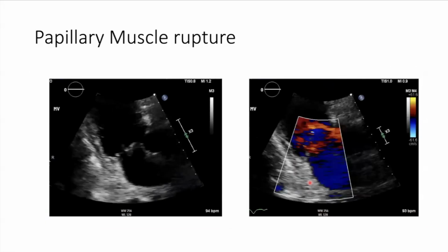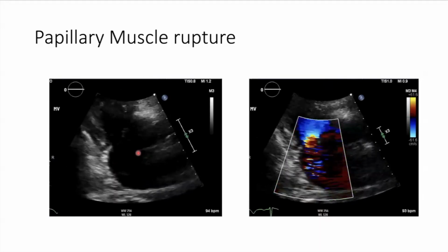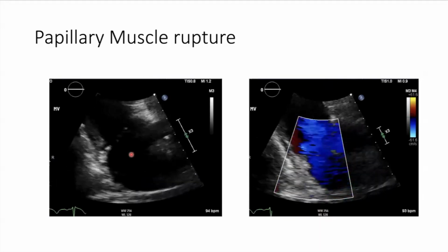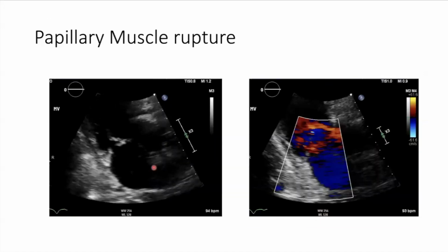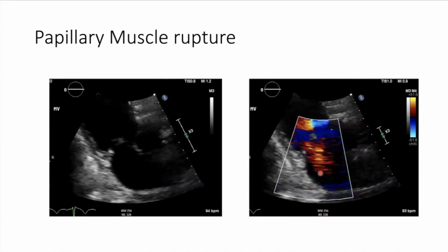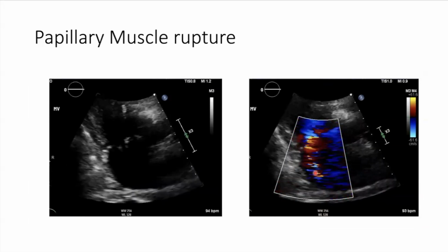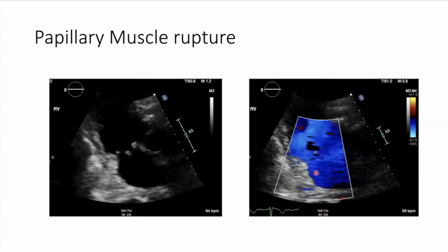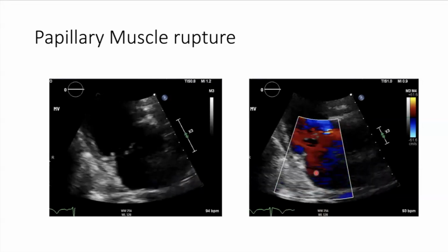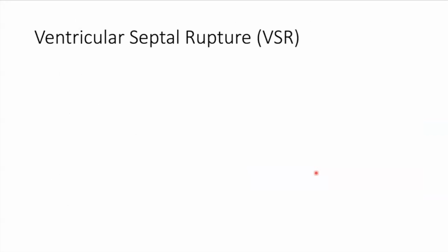All right, so moving on, this is just another example where we see the mitral valve better. You can see the flail of the leaflet here. When you put color over it, we can see if there is turbulent flow and regurgitation, but this is what I meant. It's not quite clear, it's not obvious the way it is in that picture. But if we were to put color or continuous wave Doppler, we would see a very dense jet, or a dense profile.